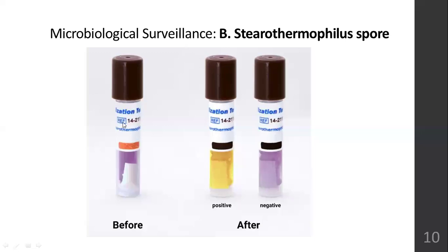These microorganisms also show whether a sterilization process was able to kill a specific number of microorganisms or not. Endospores, bacterial spores, from any bacteria which has spores, are the main type of biological indicators which we use in CSSD. Geobacillus stearothermophilus is also used, and another type.